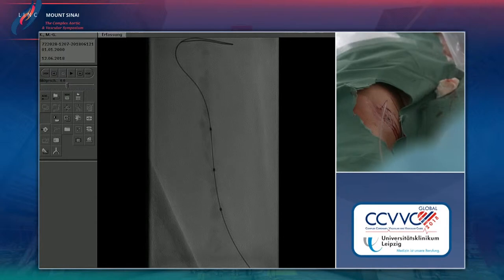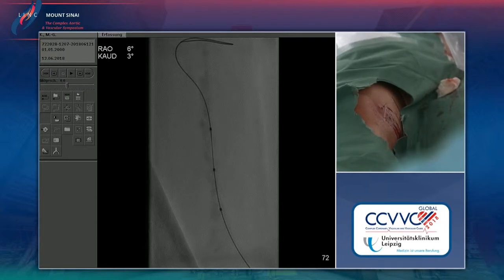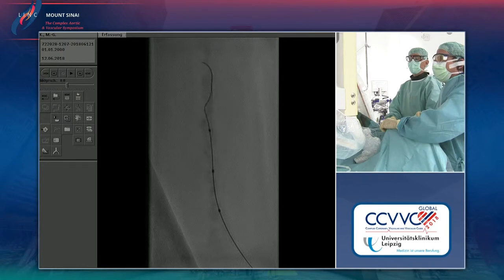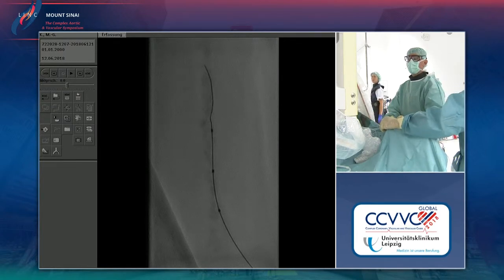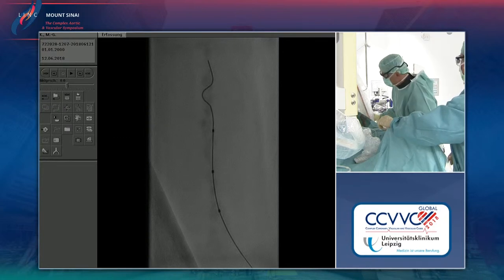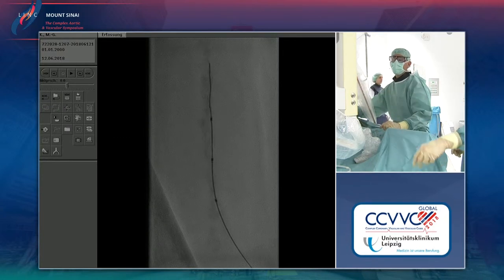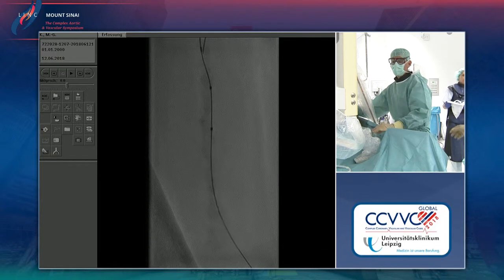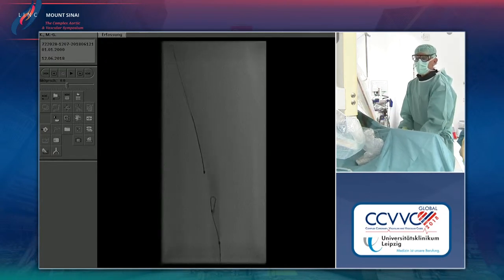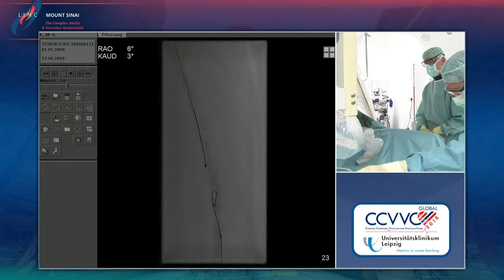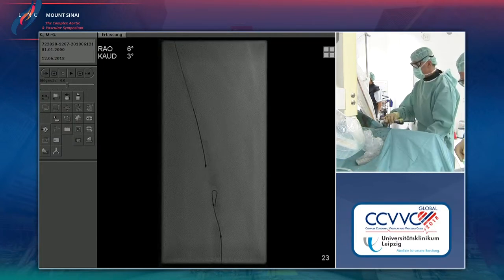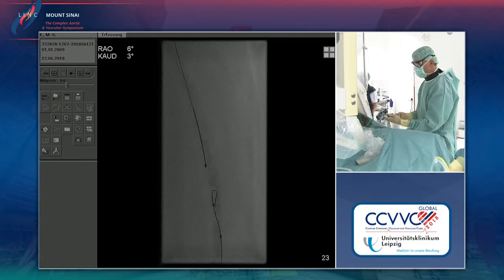That's not so bad. Now we have to find the right way upwards. Let's try a Command wire. What we have not done yet is to balloon from proximal — I think this will facilitate wire passage if we pre-dilate here. So this here is a 4 by 120 balloon.